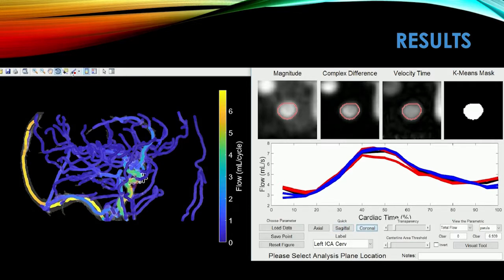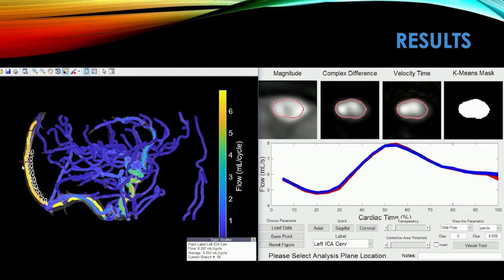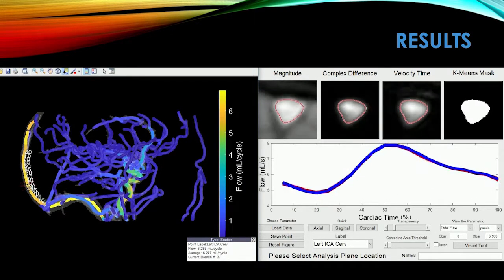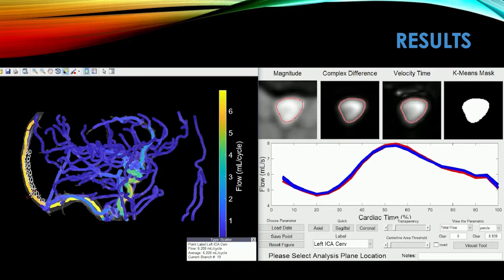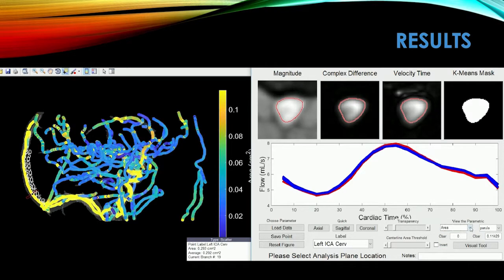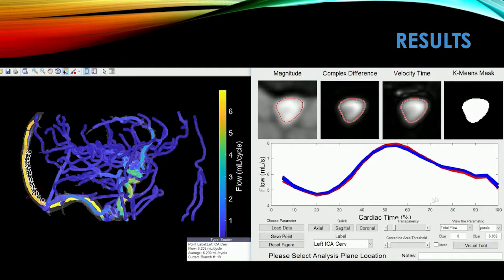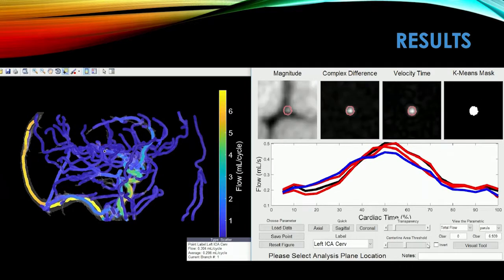Those are automated vessel segmentations, so you can look at different locations. To analyze, you click a point and then move it. It gives you a really nice way to look at the pulsatility as well as the segmentation you're completing and all the different vessels. We have quantitative parameters built in, so you can do area, whatever you want to compute. This is easy. If you want to add additional things, you just plug in your code and it's ready to go. And what's showing here on the pulsatility, we have 5 different waveforms, so it's 2 before and 2 after to make sure you're in a stable location.